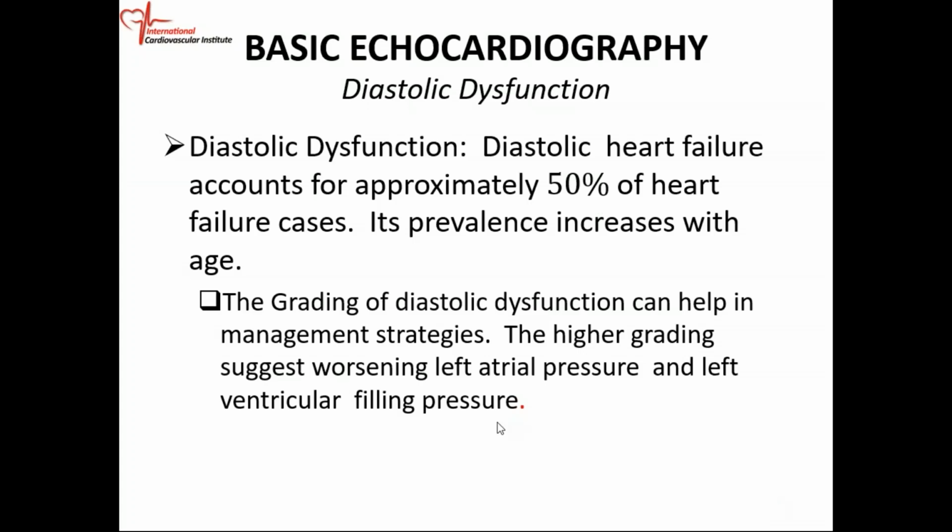Okay, so again, we went over diastolic function, and at this time, everybody should be able to recite what the parameters of diastolic function are. When we talk about diastolic function, what are we really saying? What are we looking at? Again, remember when we say diastole, that's when the heart fills with blood. The heart starts to fill with blood when the aortic valve closes.